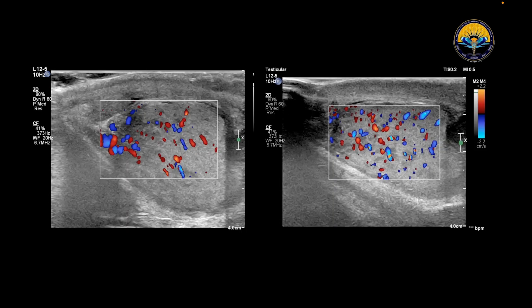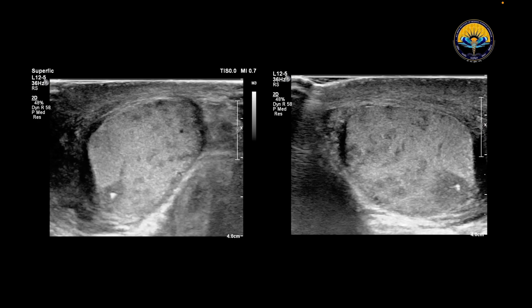Here we can see there is increased vascularity on both the testes on CDI. There are also a few specs of calcification. So these are the multiple hypoechoic areas and these are the few specs of calcification. While doing the USG scan, we also noticed that there are bilateral reactive lymph nodes in the inguinal region.